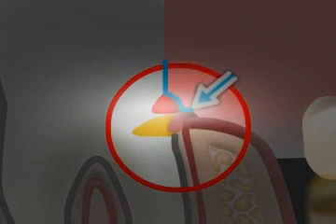In many cases, blood, saliva, or the gums themselves obscure the preparation margins. Thus, if the impression is taken without the appropriate preliminary work, the impression material is not able to surround the preparation margins. This results in a dental impression with missing borders.